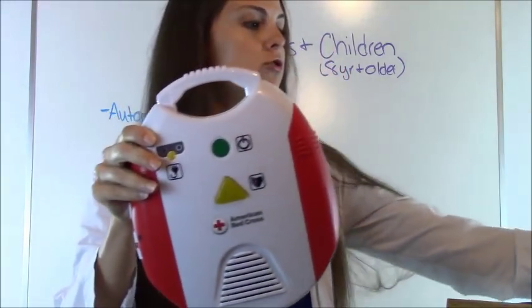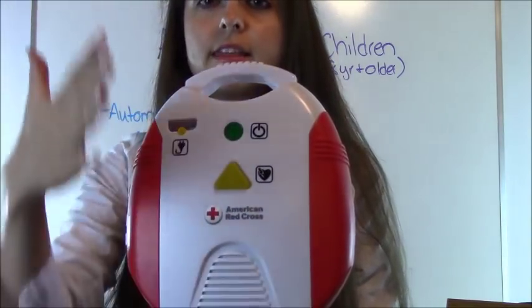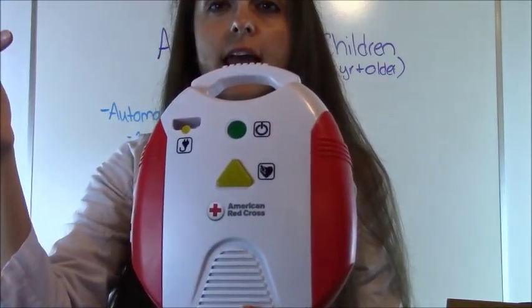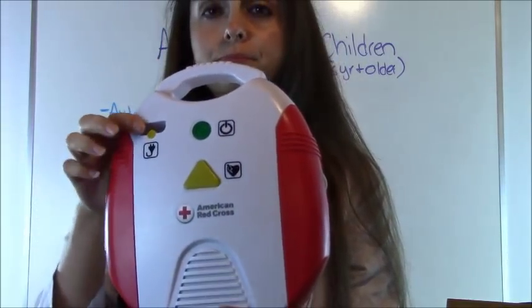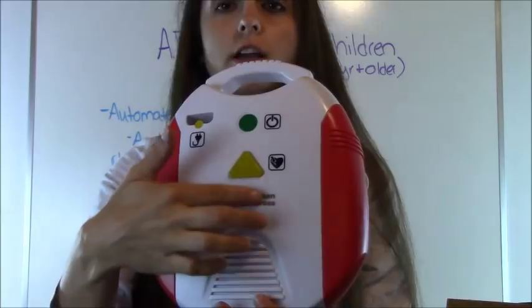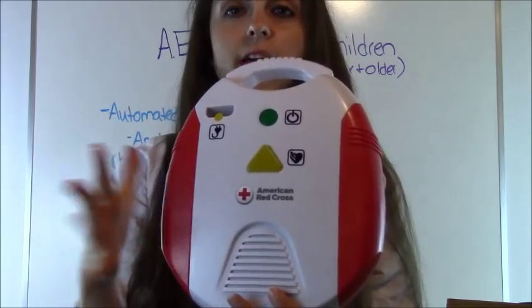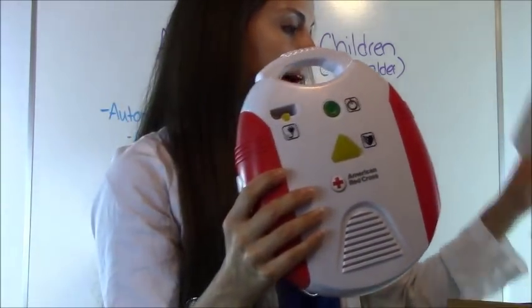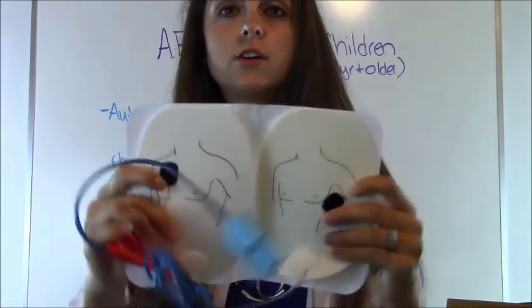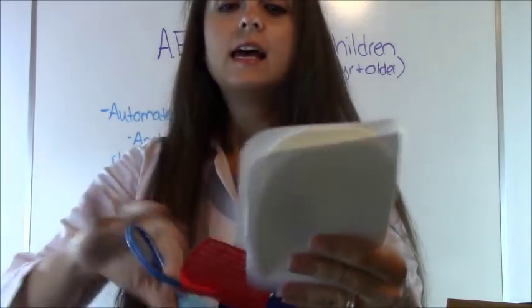The AED looks like this — they do look different, this is just one type. The green button is your on button. They are very simple to use; it tells you everything to do. You turn it on, it tells you to connect the pads, then it says 'analyzing,' and when it's ready to shock you hit the yellow button — after clearing the patient. You have different sets of pads; on adults and children eight and older you use adult pads, and the pads show you exactly where they go.